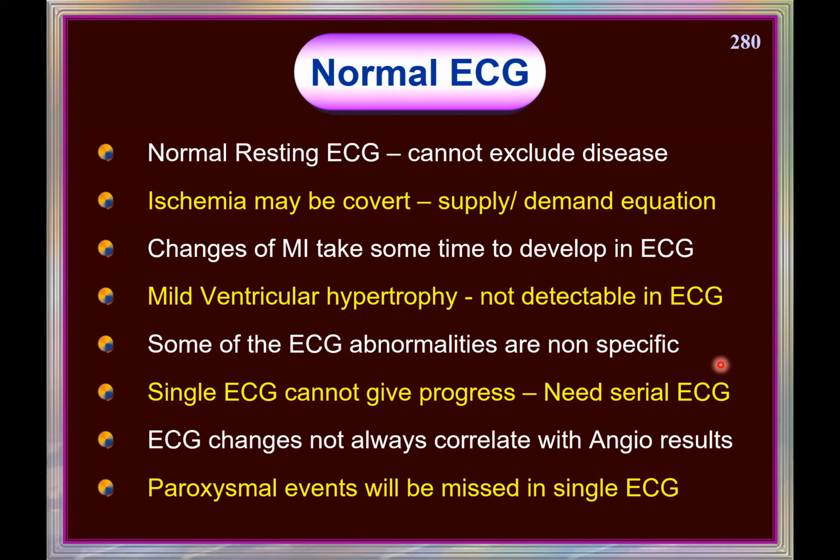Four things are important. Is there LVH? Is there any wall motion abnormality? Number three, are there any valvular changes? And of course, is there any systolic dysfunction and diastolic dysfunction, the ejection fraction and the diastolic dysfunction? These are the four fundamental questions in the echo: LVH, systolic and diastolic dysfunction, wall motion abnormalities, and valvular abnormality.